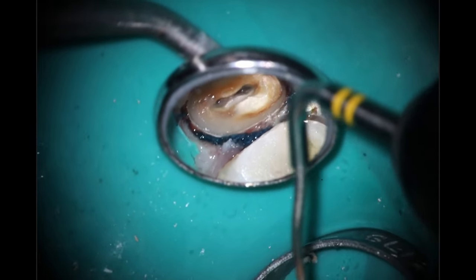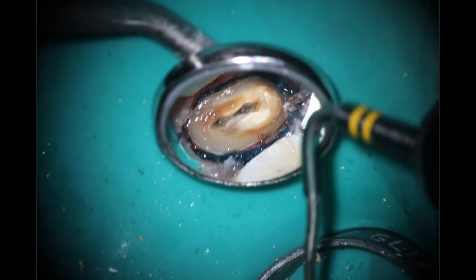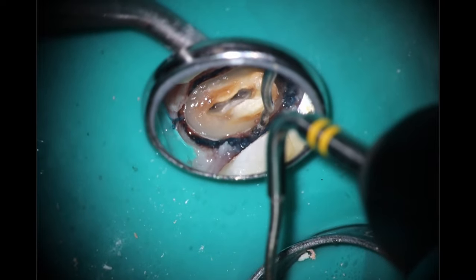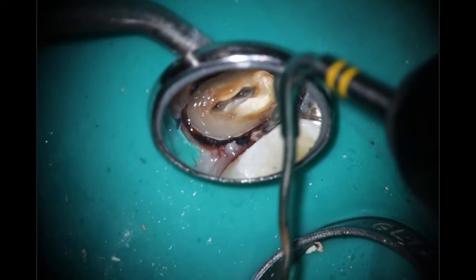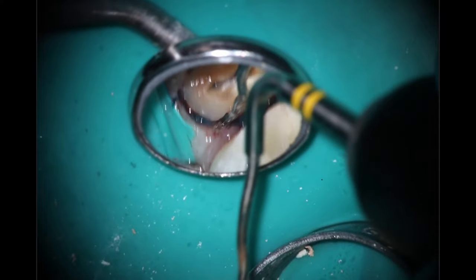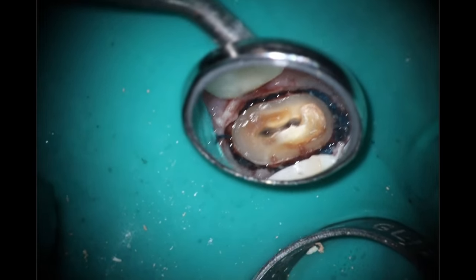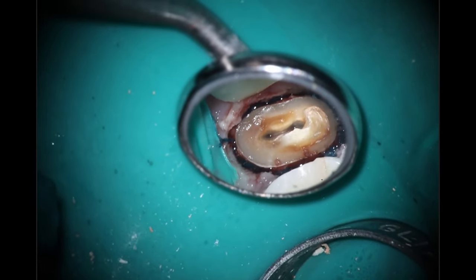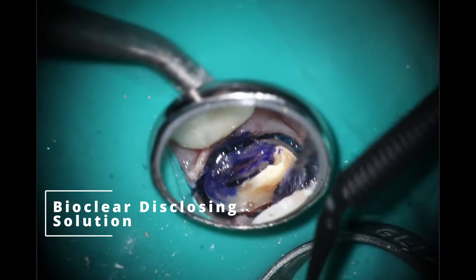She had really nice, healthy gum tissue. If it had been inflamed or there had been issues from caries, I would be more likely to take everything out and change that inflammatory gum tissue to traumatic tissue by doing the preparation with both the alpha and the rotary high speed — that just helps heal up the area faster. Sometimes it's better to remove the gum tissue and start over fresh; sometimes it's better to try and keep it. I use the alpha like a little cauterizer — you can tap any spot that's bleeding to get everything under control before starting the restorative process.